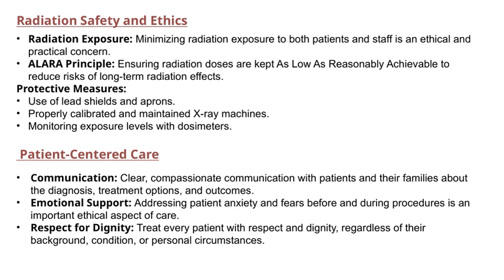To achieve this, we use protective measures like lead shields and aprons, which act as barriers to radiation. We also make sure our X-ray machines are properly calibrated and maintained, so they operate safely and efficiently. Monitoring exposure levels with dosimeters is another key step, helping us keep track and stay within safe limits.